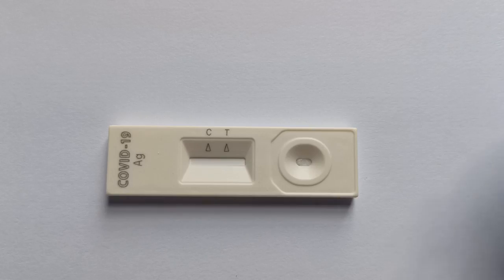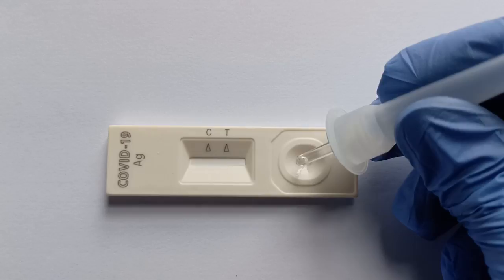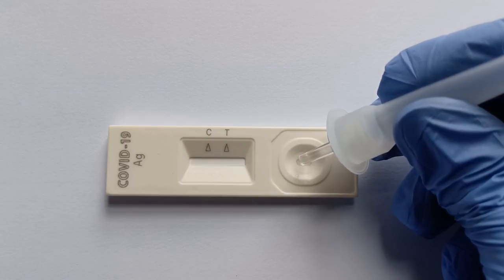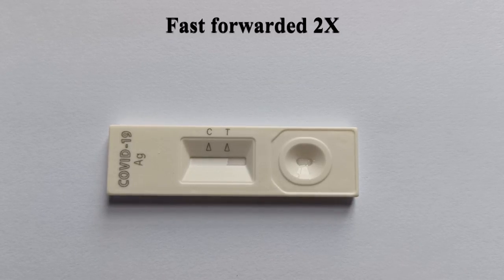Without any delay, add 3–4 drops of the extracted specimen from the buffer tube onto the specimen loading chamber of the test cassette. Leave the cassette undisturbed for a few minutes. You will notice the liquid sample begin to travel along the entire length of the nitrocellulose membrane of the test strip.